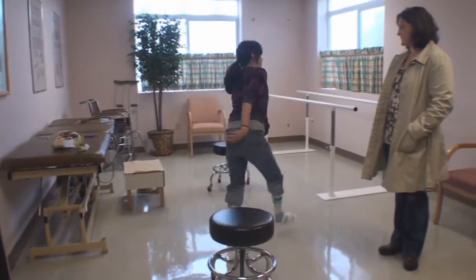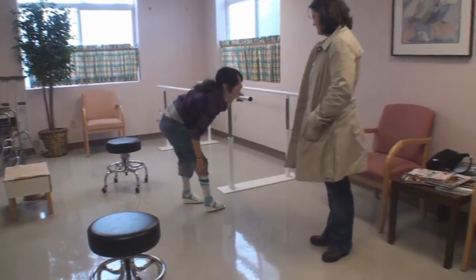If you're new to bracing, it's very hard to judge because it's all a new experience. With some patients, there's a lot of discussion as to level of stability and what types of movement they're interested in. But because she's worn so many of these, she knows almost exactly what she wants and can judge a brace really quickly.